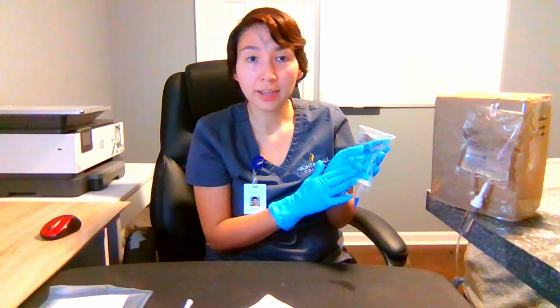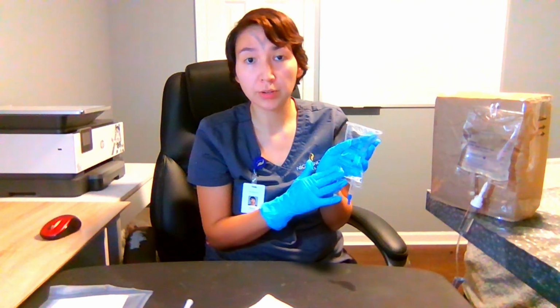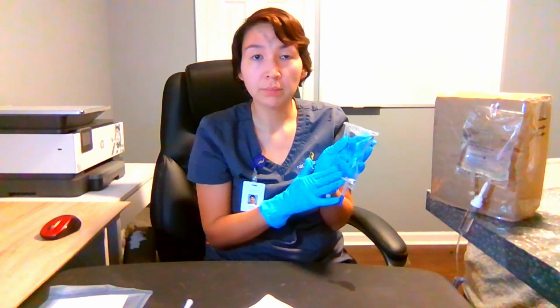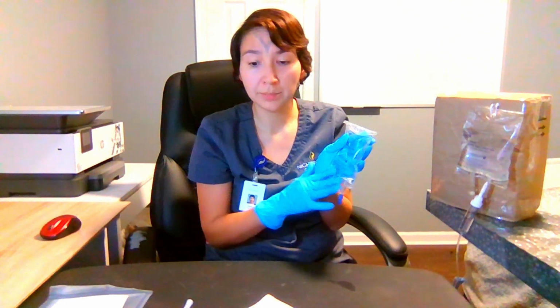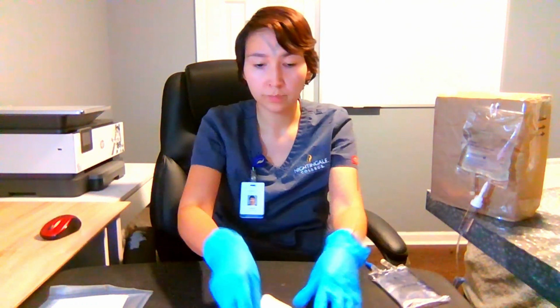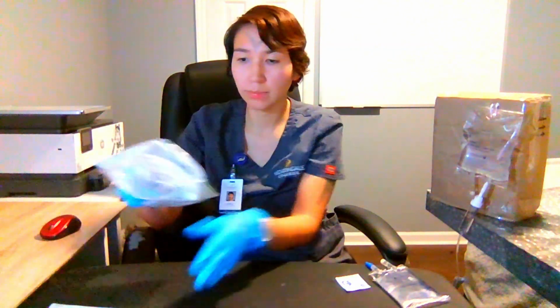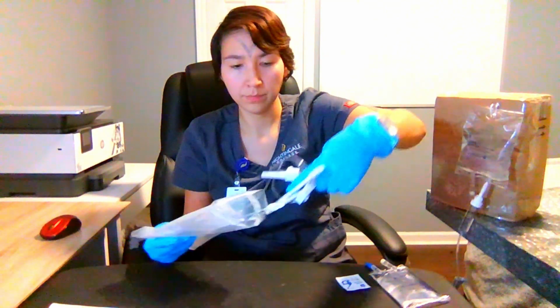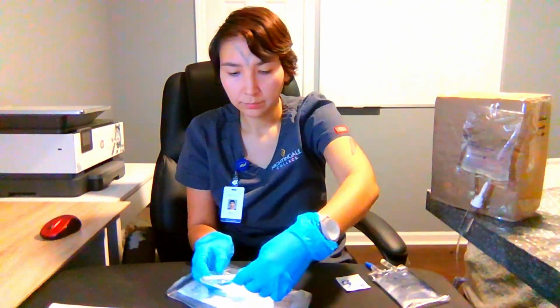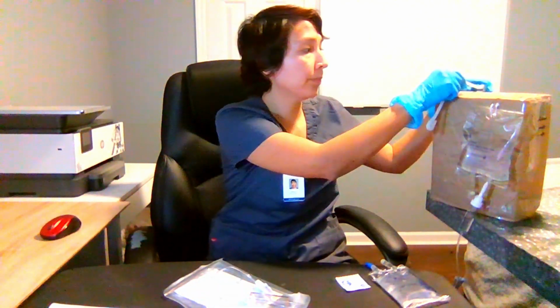I have confirmed that this is the ordered medication, amoxicillin, 250 milligrams in 100 ml normal saline with my secondary set. I'll prepare the hanger.